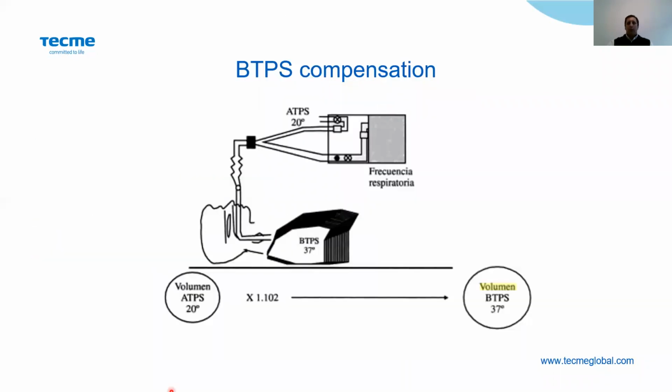Let me make another poll. So the question here is, when the BTPS compensation is activated, is the delivery of tidal volume from the patient outlet the same as we have set, lower than we have set, or higher than we have set?